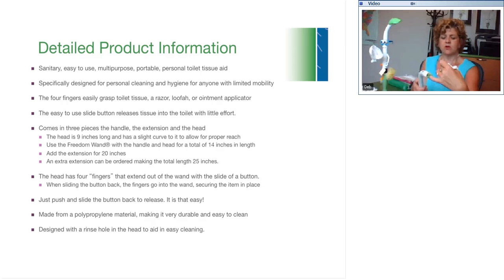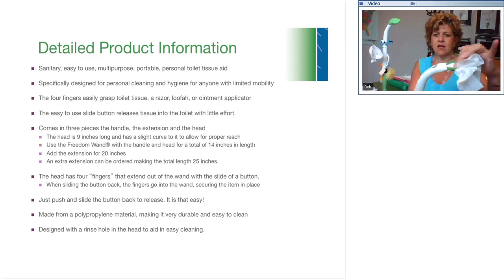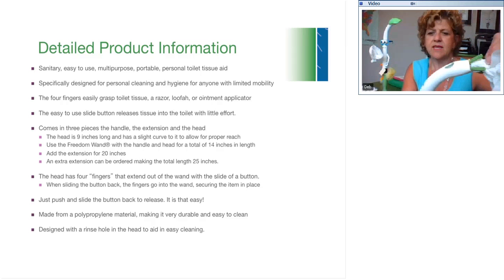Because the grippers, if you can put your fingertip, your pinky, in the edge of the gripper, it's about that dimension. Whatever you put in that dimension, it's going to hold nice and firmly. So by putting the tip of the tissue deep into the grippers, and I'll let you get a closer view of this, you put the tip of that tissue deep into the grippers like that, and then you pull it all the way in. It's going to hold it really firm.